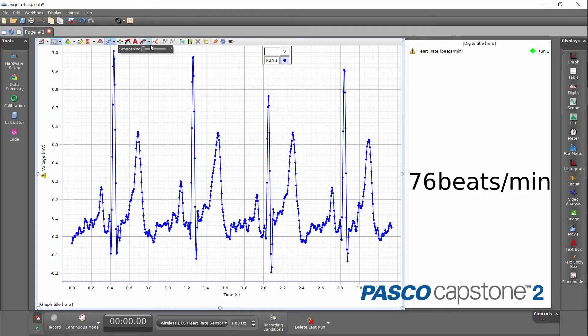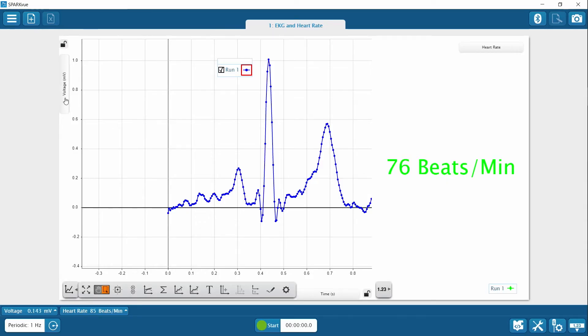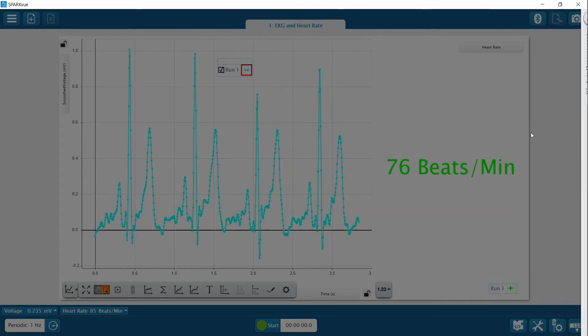If you have noisy EKG data and it's hard to see the individual waves, try smoothing the data. Capstone has a smoothing slider, but in SparkView you need to perform a calculation to accomplish smoothing. Since we used the quick start file, we can just choose the voltage measurement, switch to user entered, and choose the smooth voltage measurement.